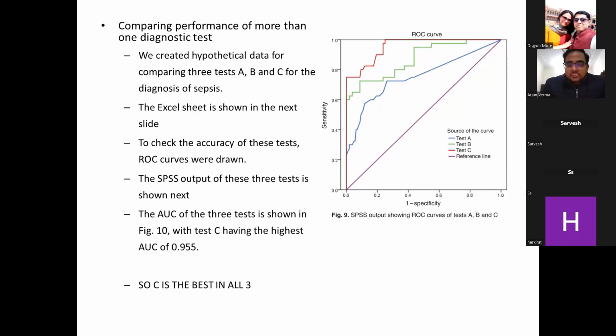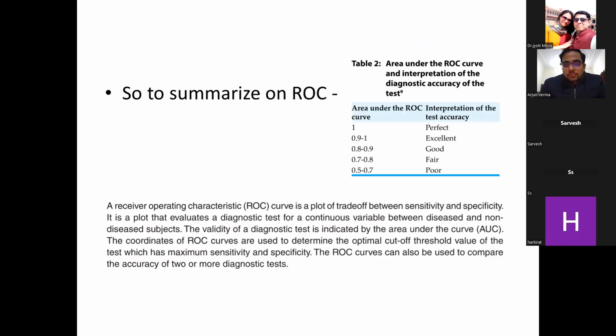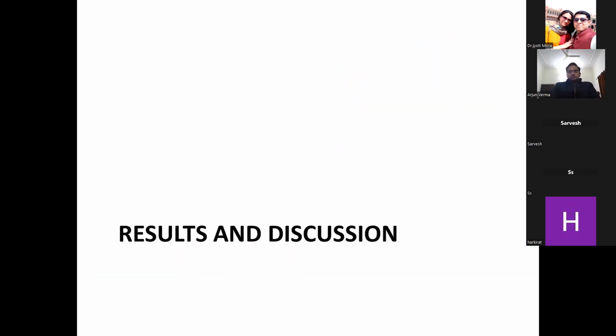And let's discuss the modified lung ultrasound score and classical lung ultrasound score on the ROC curve. So over to you, Jyoti. Please continue the journal club part of the article. Continue to the next slide, please.